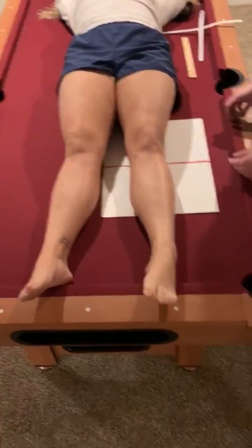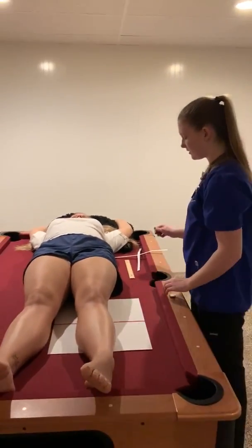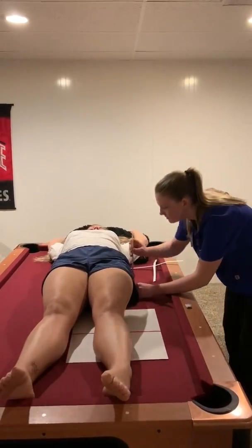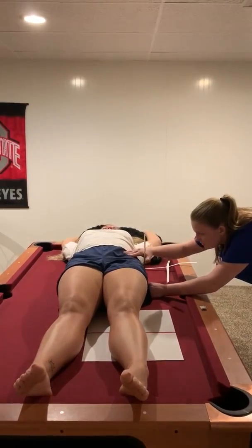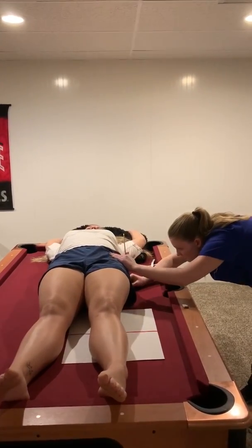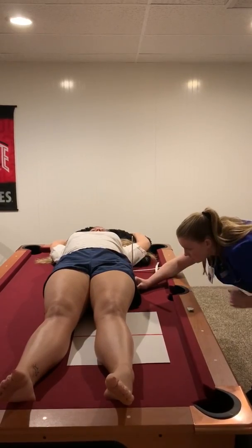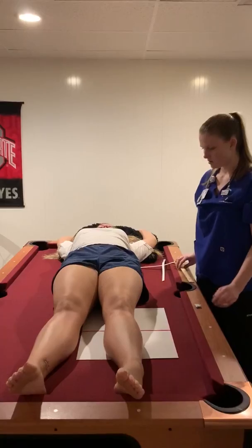And I'm going to make sure everything is realigned and in detent. But since everybody has different hips, you're going to want to check from where the ASIS is to the tabletop to see how much it is. So she's about 20, so I wouldn't have to put an angle on the tube.